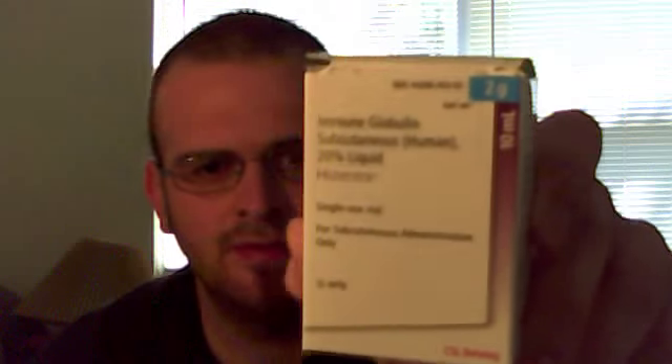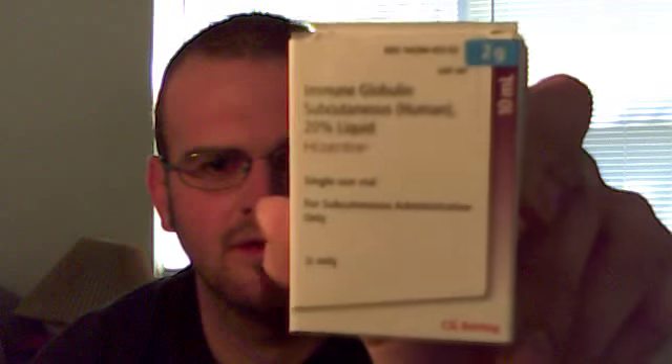What is up YouTube? I'm here with a little bit of a different side of me. Today is my day for my immune globulin infusion. I'm actually on 50ml, which would be 3 bottles — 2 of the 20ml and 1 of the 10ml. Here are the 2 twenties and then here is the little 10.